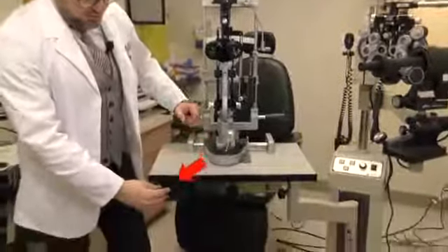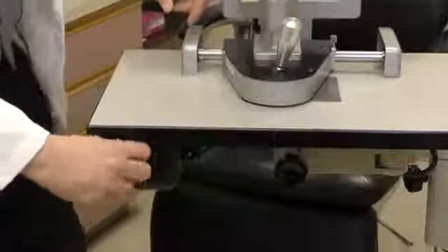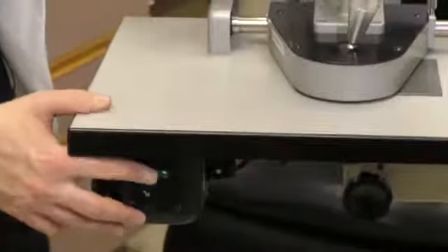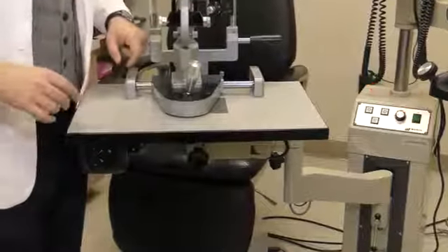So to begin, we're going to start with how to turn on the machine. If we can draw your attention here, there's a little knob that allows you to turn the power off and to turn the power on. What you want to do is turn it all the way to get the power on, which in this machine you turn clockwise, and you'll see the indicator light showing the power is on. Sometimes there's actually a power switch on the arm of the slit lamp or on the base, so always make sure that that's on as well.